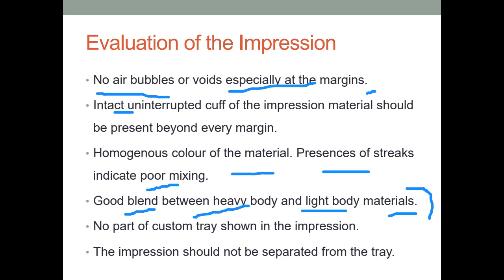No part of the custom tray should show in the impression, so proper space should be provided for the impression material. The impression should not be separated from the tray. As I told you, if it is separated from the tray, there are more chances of shrinkage of the material, and your final cast will be distorted.